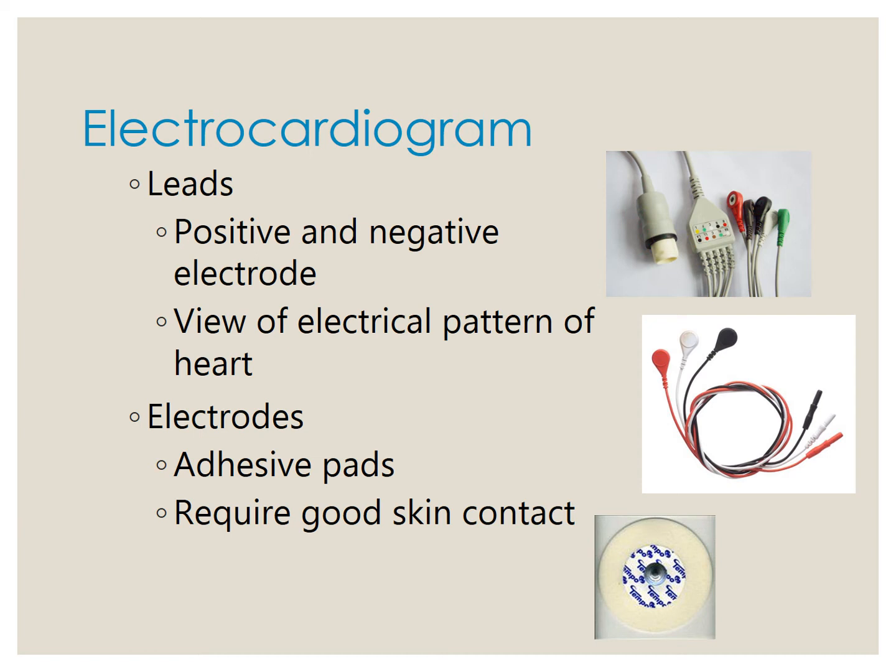There are other types of electrodes. Some of them look like little tabs, with conductive gel just on the end of the tab. But whatever type it is, you do want to make sure there's good skin contact and adequate conductive jelly in the center of the electrode. So if you have a client that comes in really sweaty, or maybe they were out working in the garden and you think they come in having chest pain, if they're dirty, you need to make sure that their skin is clean. That way you will have good conduction through that lead.